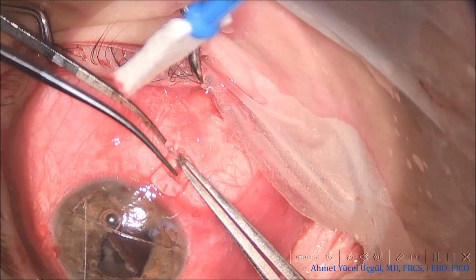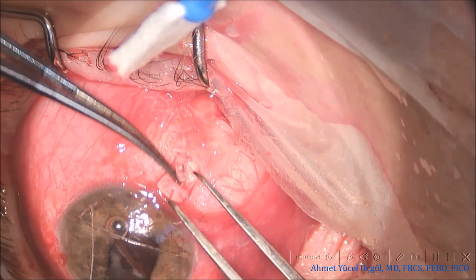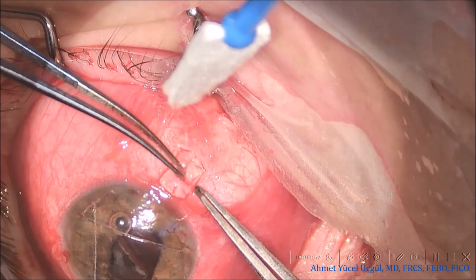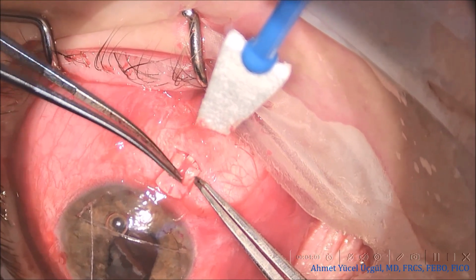The bevel angle is also important. A more oblique cut produces a sharper tip, facilitating smoother and more controlled sulcus entry. Finally, two-instrument manipulation improves tube control and helps guide the tip more precisely into the sulcus plane.